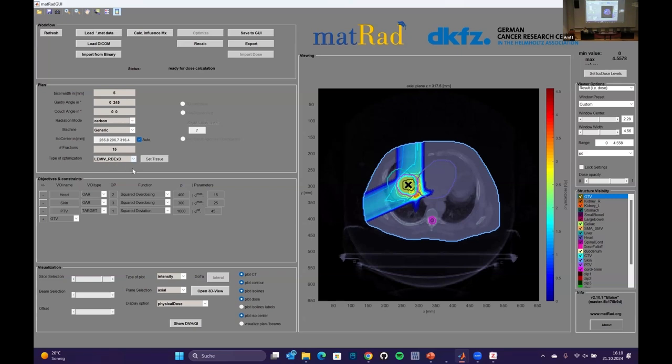There are a lot of physical research avenues down this way, so you can look into microdosimetric quantities if they relate to that, or nanodosimetric quantities. But in principle, you need to apply a biological model that models this change in depth of the biological response. And the model that we have here is called the local effect model, LEM4.